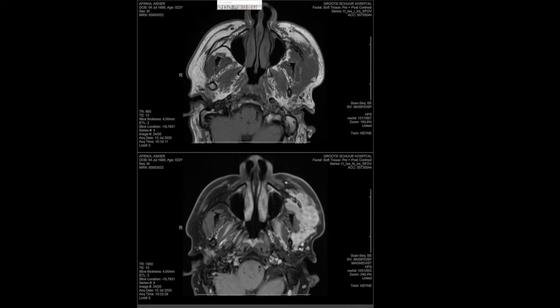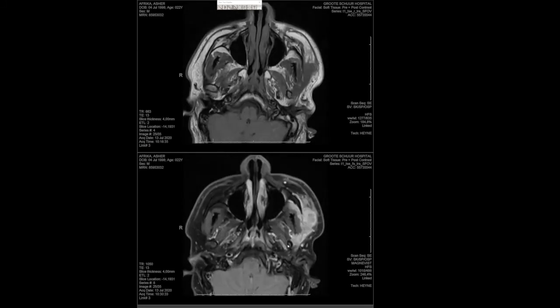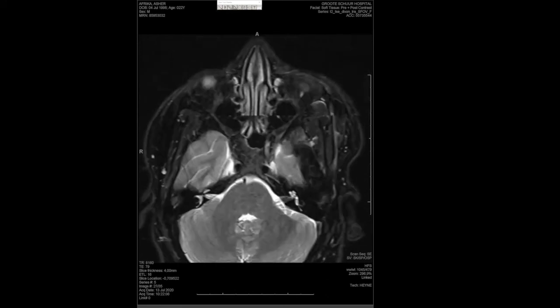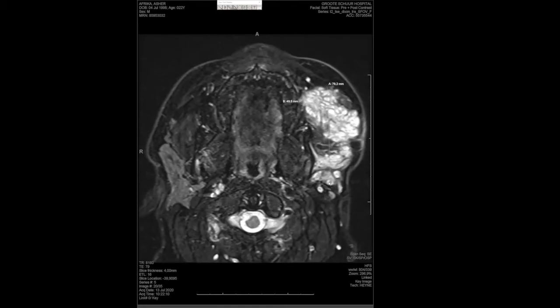I think the question was whether there was also facial nerve involvement. The cisternal segment of the facial nerve was definitely not involved because the mass is not in that location. To show you on T2, this is the cisternal segment of the facial nerve. However, the extratemporal segment or the superficial branches usually arise from the anterior aspect of the parotid gland. Because of the extensive infiltration into the parotid region, we thought that at least the origin of these branches are involved. However, we don't have a high resolution MR study to clearly demonstrate the facial nerve, so we had to assume that there is involvement of the origins of these superficial branches.